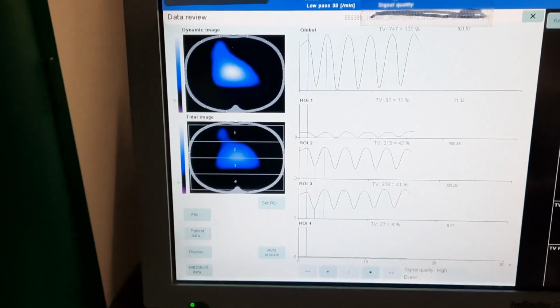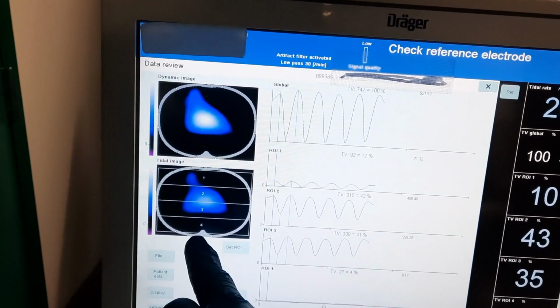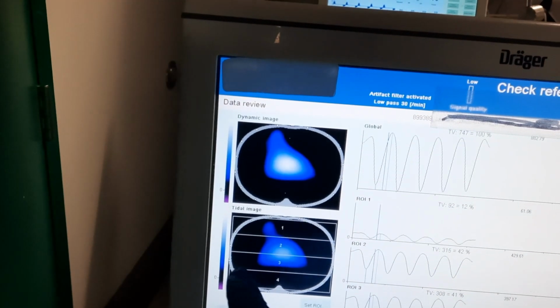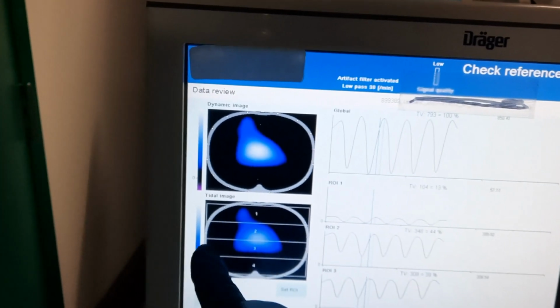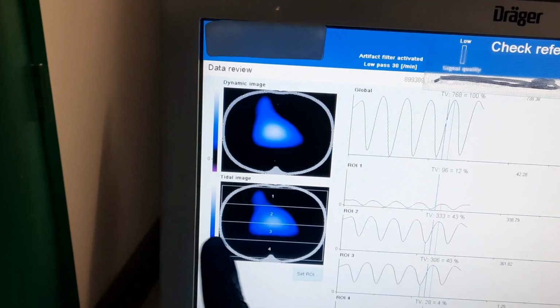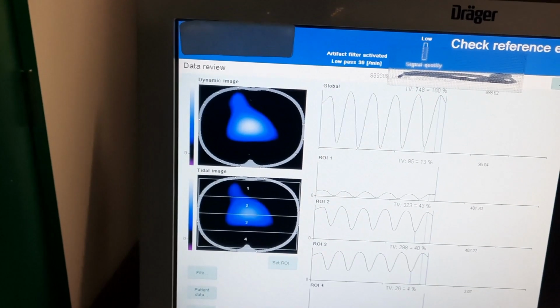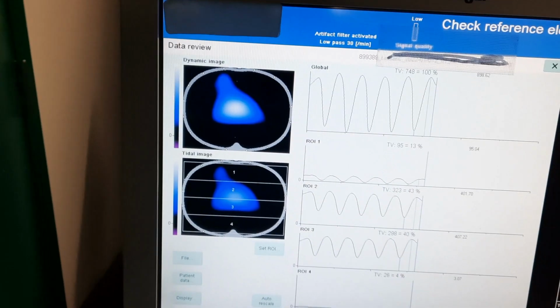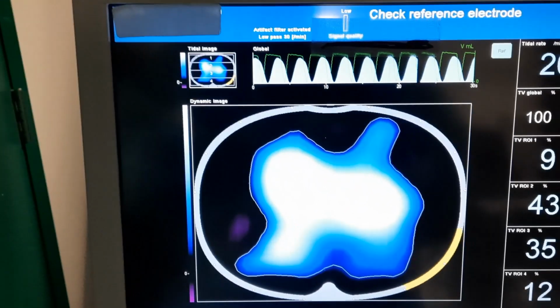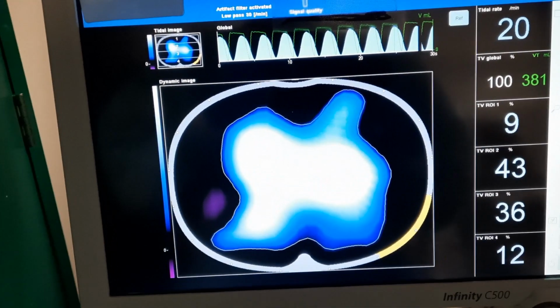This is yesterday, the 12th. This is what I was talking about, the distended abdomen and the extremely dilated colon. So we see that this is a patient when the patient's on a supine position, and you can see due to that increased pleural pressure and a complete elimination of aeration at the dorsal region. So we decided to flip the patient at the end of the shift, and here we are this morning finally with this result. So very, very good result with the proning.